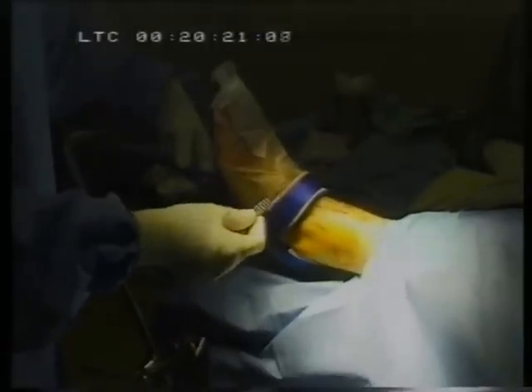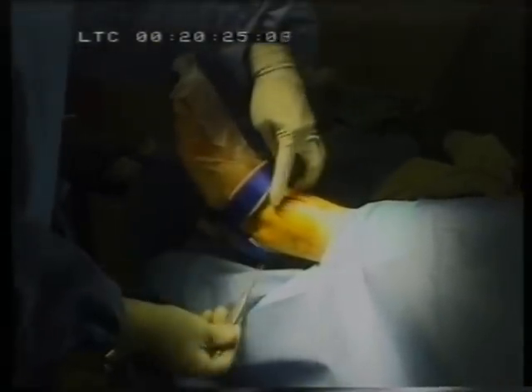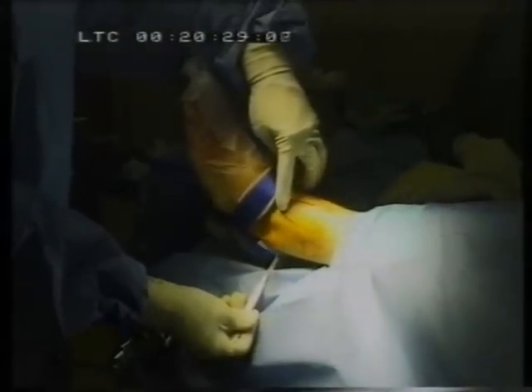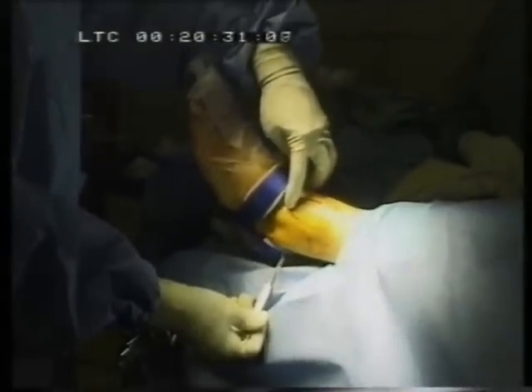This is an ankle strap. The ankle strap is placed so that the foot is elevated. This allows you to get to the front of the ankle and also to the posterolateral aspect of the ankle, which are the most common portals that you may need to use in order to perform your ankle arthroscopy.